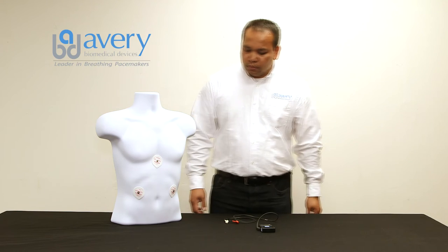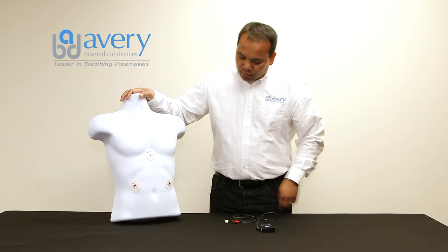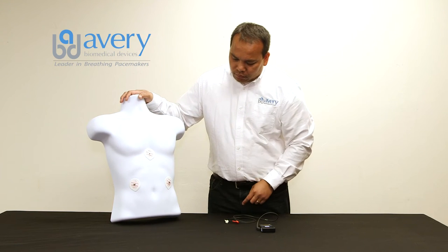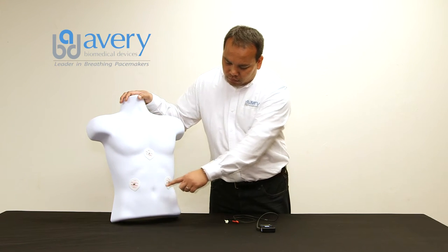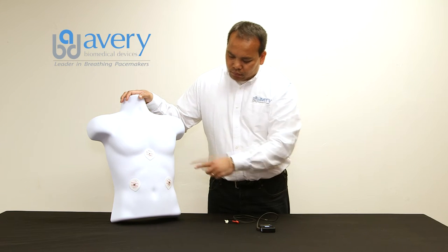For a patient pacing bilaterally, stimulating both sides, three skin electrodes are required. The first and second skin electrodes are placed just below the left and right lower ribs, while the third skin electrode is placed in the middle of the breastbone or sternum.